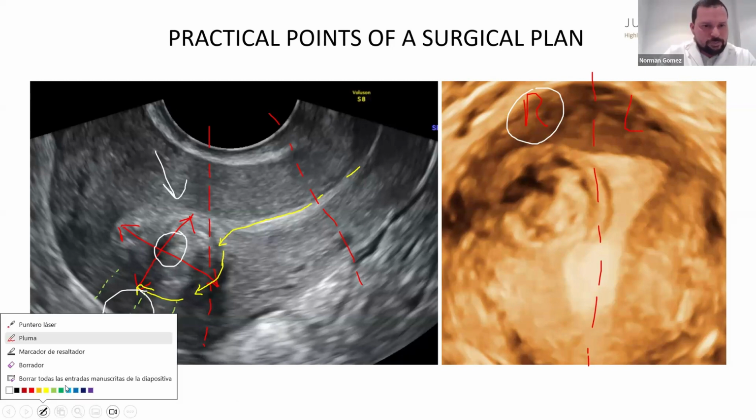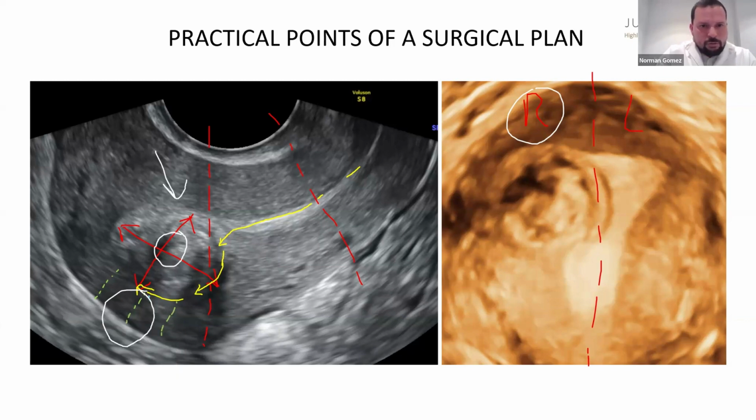inside the operating room. So this is my opinion: the optimal safety distance between the fibroid and the serosa, I can say, will be 5 millimeters, more or less. 5 millimeters, I think, is enough to go with confidence to approach a case like this, for example. Okay.